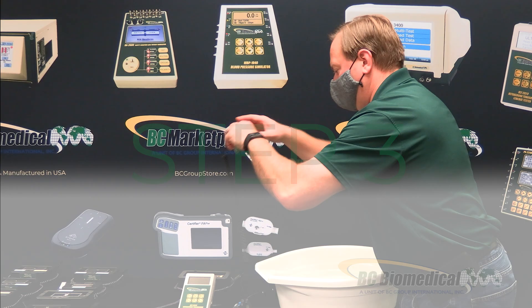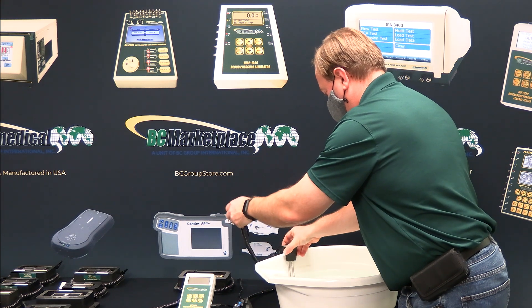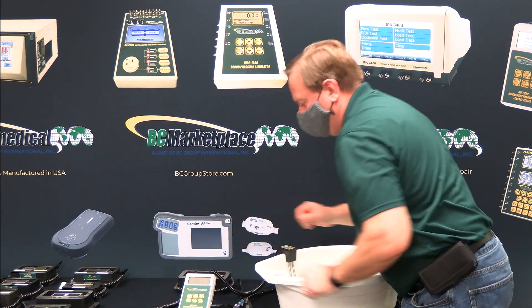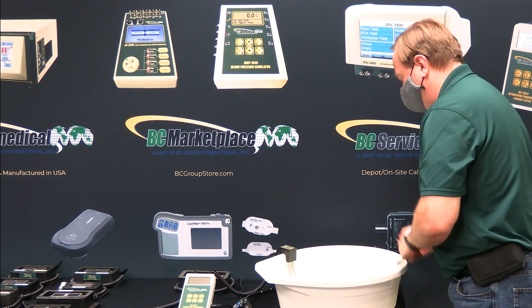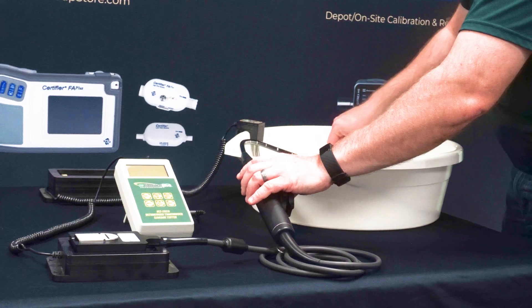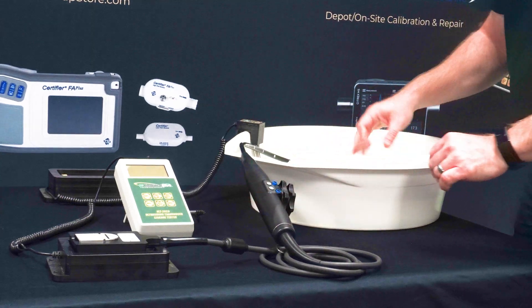Step 3: Insert your probes into the soak tray. Start by placing your dual prong conductivity probe on the side of the soak tray. Ensure the tips are fully inserted into the cleaning solution. Next place your ultrasound probe into the soak tray.